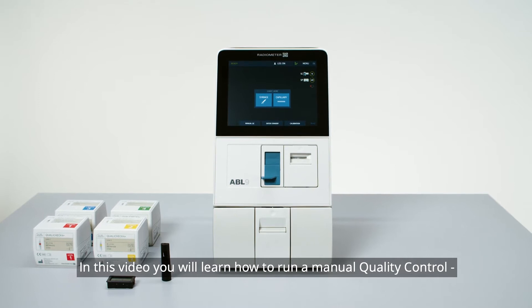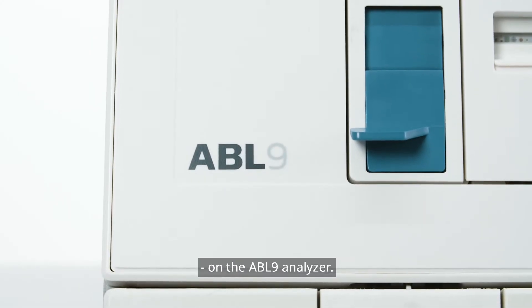In this video, you will learn how to run a manual quality control on the ABL9 analyzer.